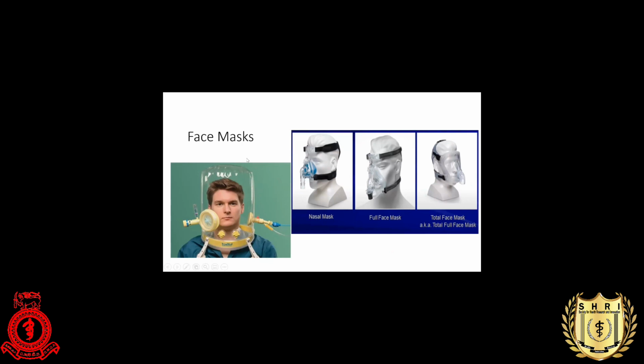These are the interfaces that we use to deliver non-invasive positive pressure ventilation to the patient. We can use a nasal mask. Usually it's helpful in CPAP patients with obstructive sleep apnea. And this is a full face mask. This is a total face mask. This is the CPAP helmet. These all carry their own advantages and disadvantages. When we talk about this, I think it's not available in Sri Lanka.